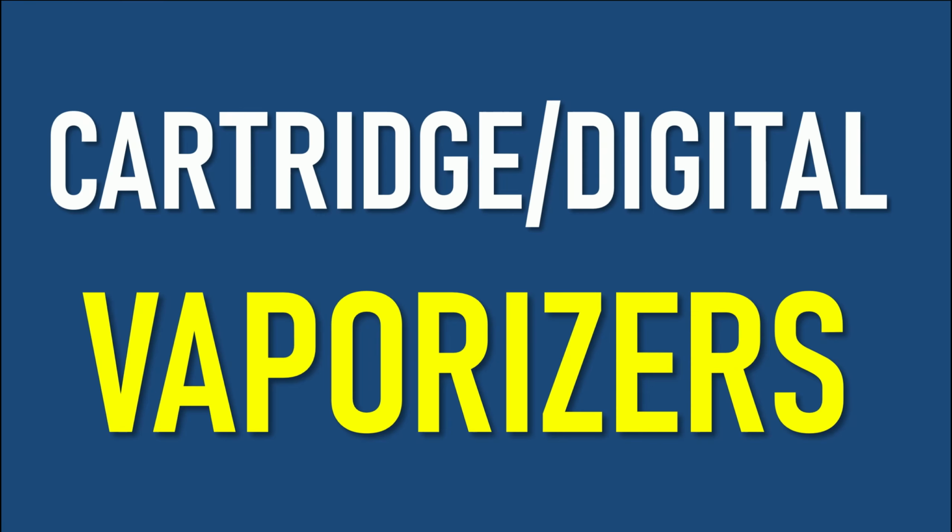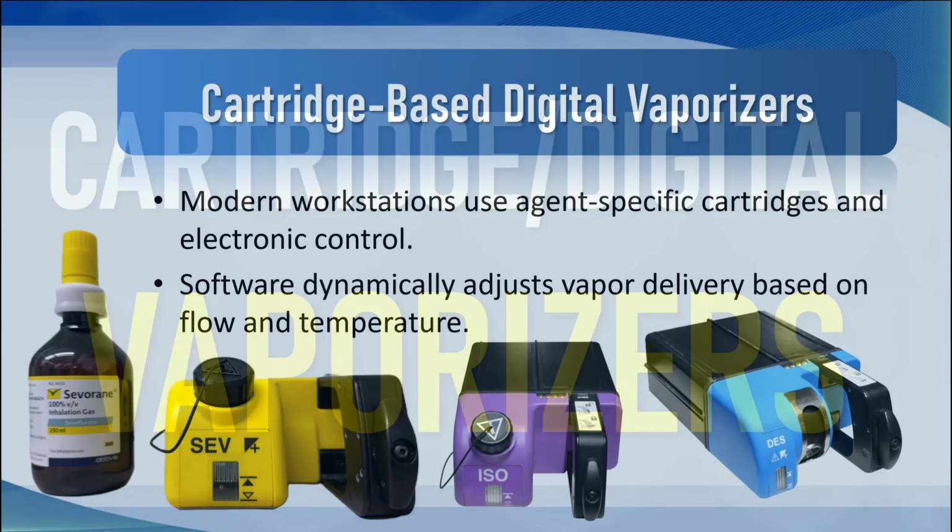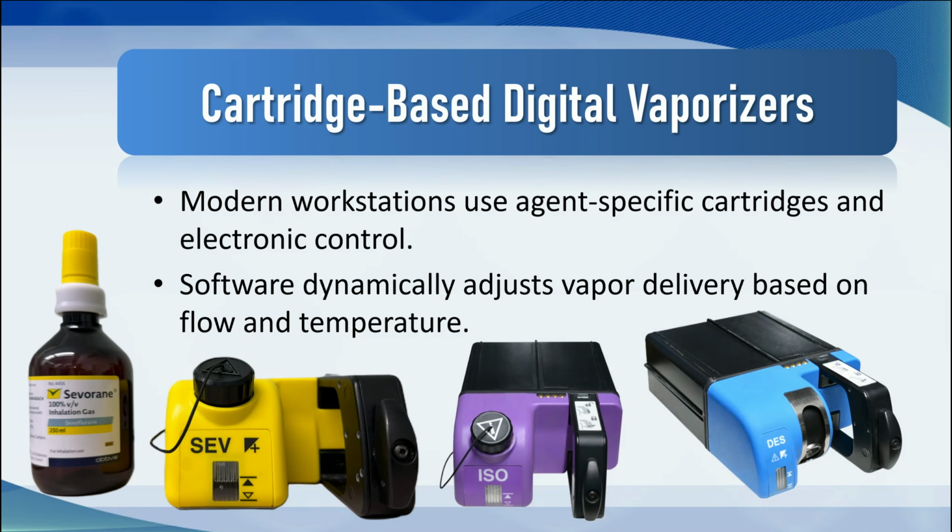If you have just started working in anesthesia, you may never have actually seen a TEC vaporizer. Rather, you may be using modern cartridge based digital vaporizers that literally plug into what looks like a purpose built insert in the anesthesia workstation.